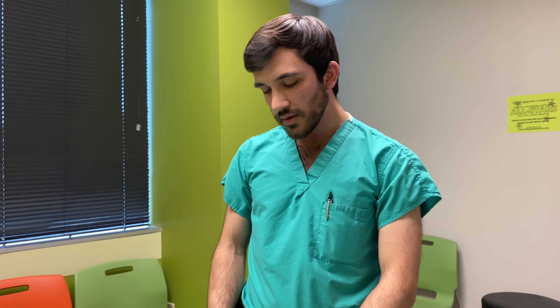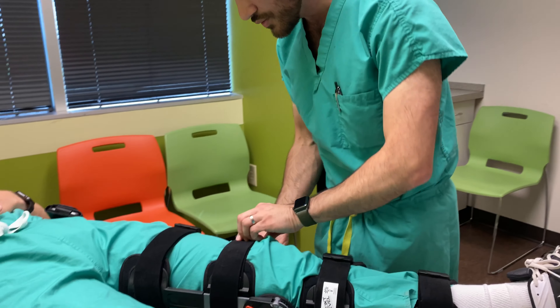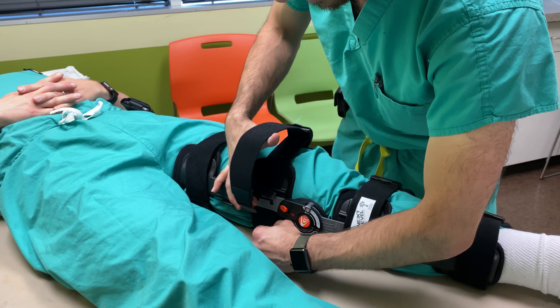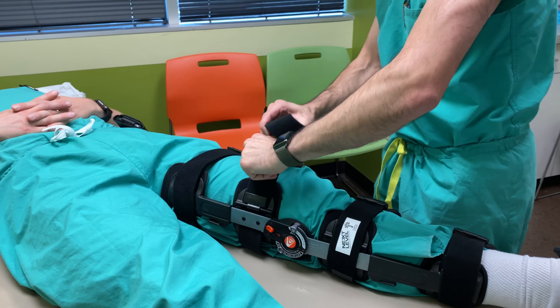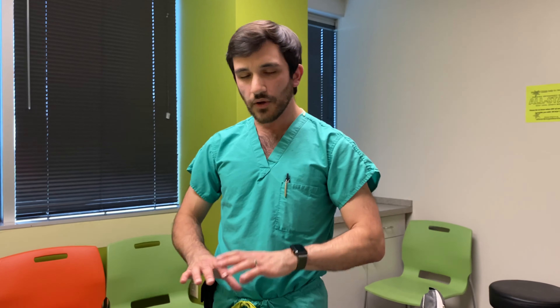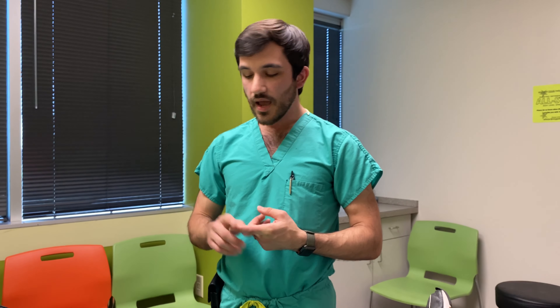Sometimes the brace can be too tight or too loose. As your swelling increases in the first couple of days after surgery, you may have to undo the clip and the velcro tab and give yourself a little slack by undoing that strap and repeating the steps discussed earlier. As your swelling goes down after surgery, follow these instructions but you'll likely be tightening the brace because the swelling has gone down and the muscles oftentimes atrophy or get a little bit smaller and weaker.